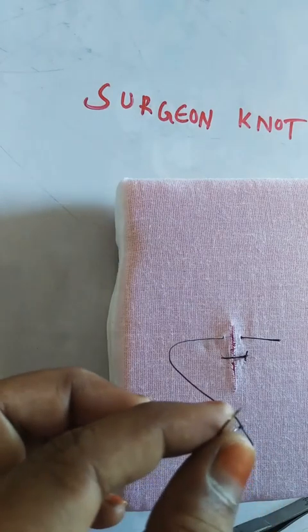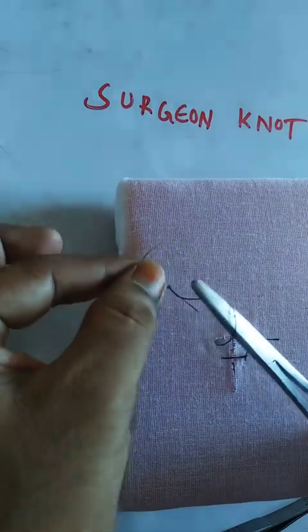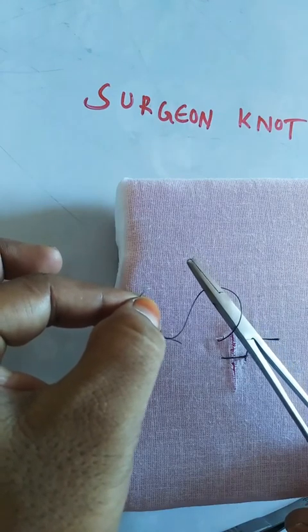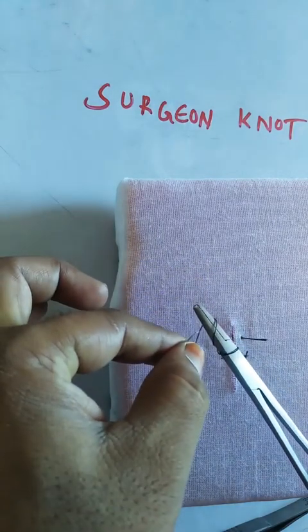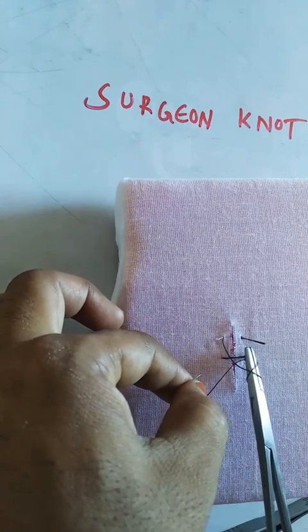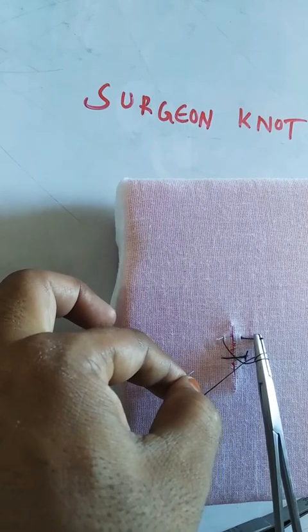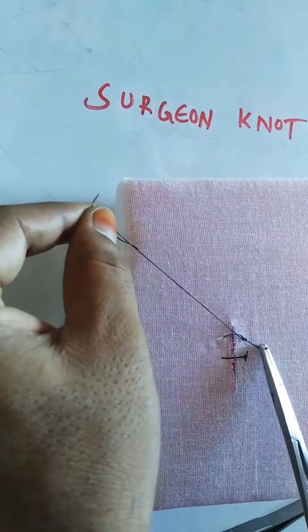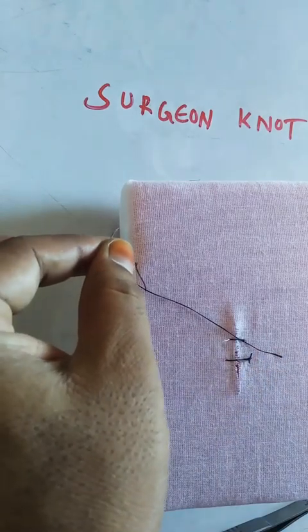So in the surgeon's knot, you should make two throws. This is one throw of the suture material around the needle holder in clockwise direction, and there is a second throw like this. So you make two throws of the suture material around the needle holder in clockwise direction. Then you open the needle holder and grab the small end, and you make the knot. This is your first tie.